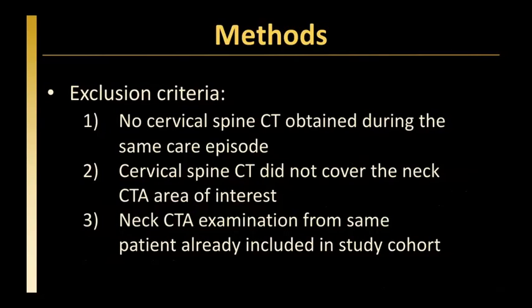Neck CTA examinations were excluded if no cervical spine CT was obtained during the same care episode, if the cervical spine CT did not cover the neck CTA area of interest, and if a neck CTA examination from a given patient had already been included in the study cohort so as to avoid counting any one patient twice.